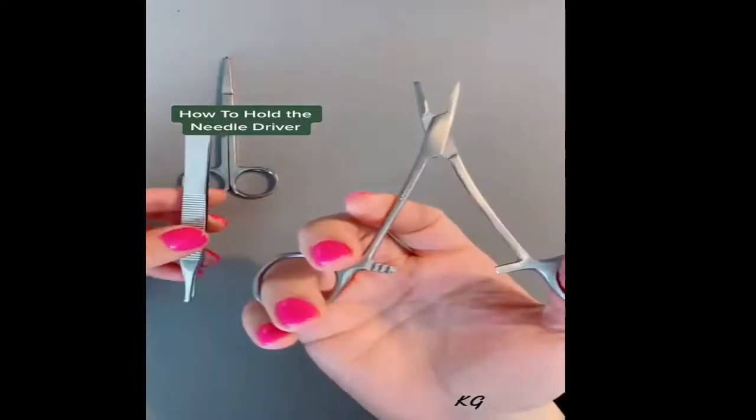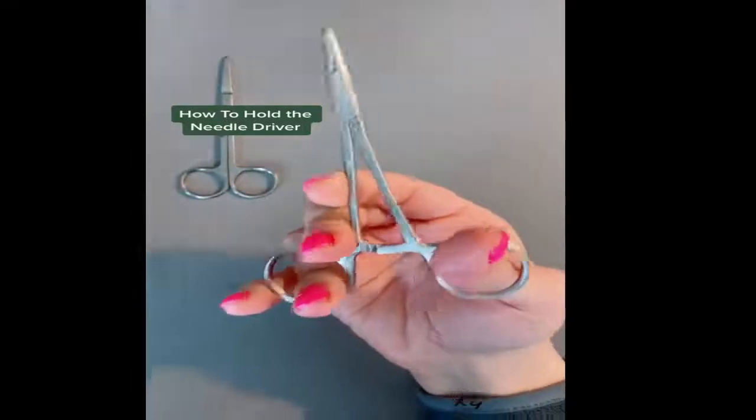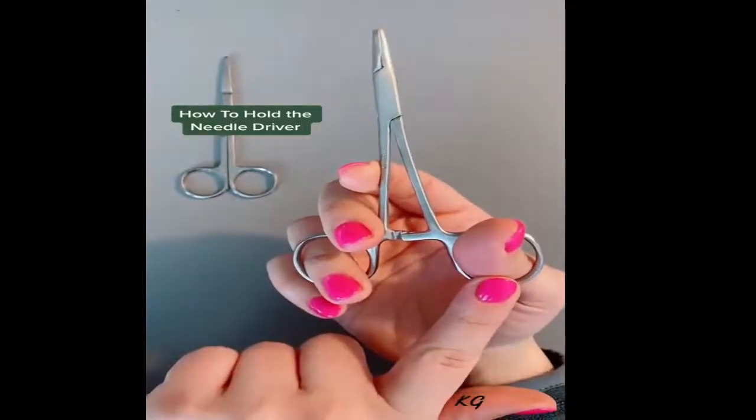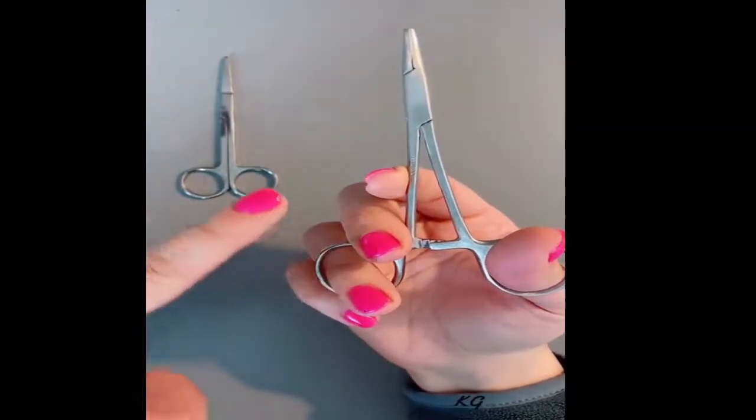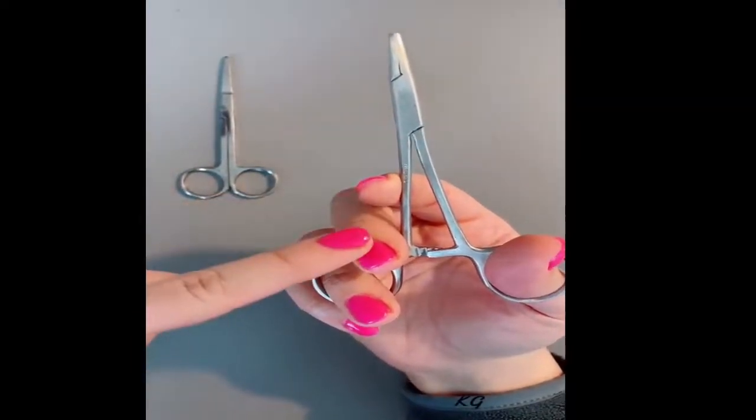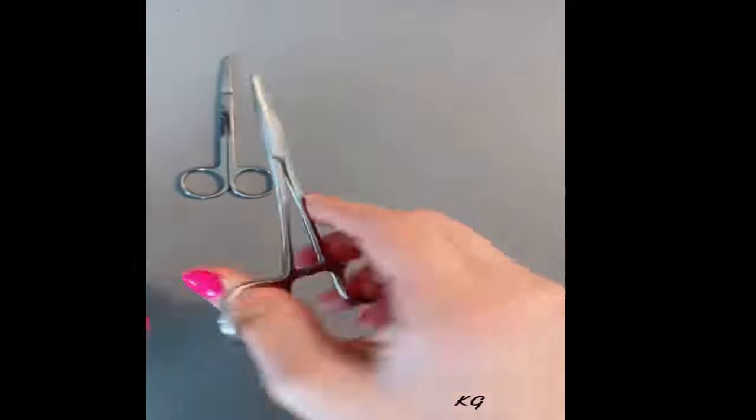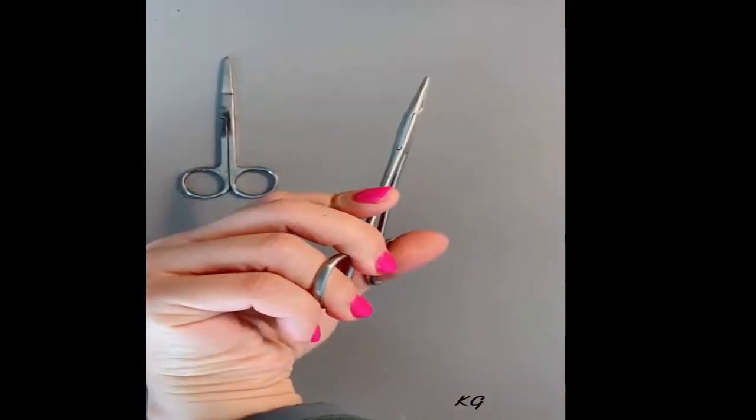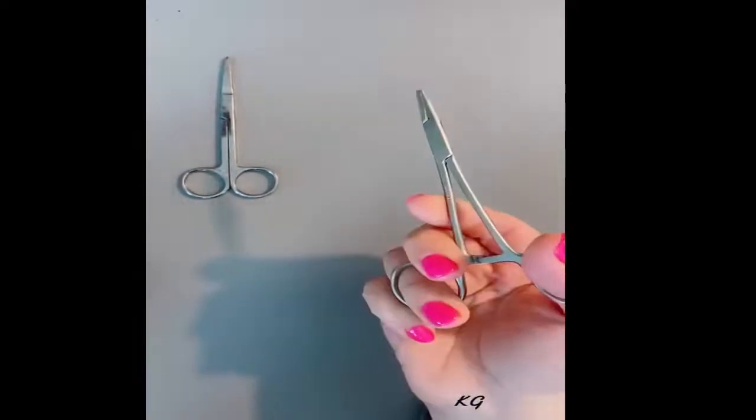Okay y'all, let's talk about how to properly hold our instruments. Let's start with the needle driver on the right hand side. The thumb goes through the first hole, the fourth finger goes through the second hole, index finger for support, third over fifth under. This is what it looks like on the other side. This is going to give us maximum support to flick our wrists as needed for suturing.